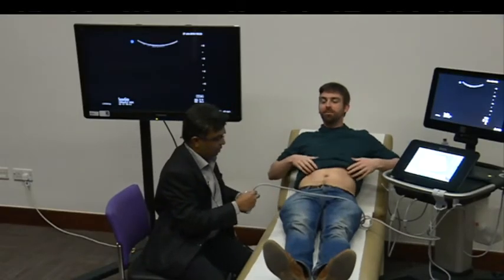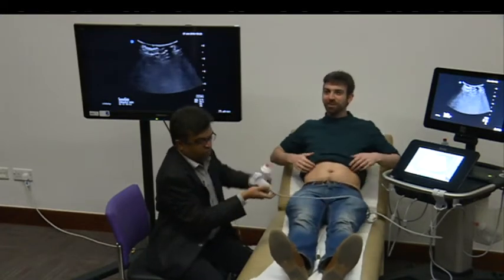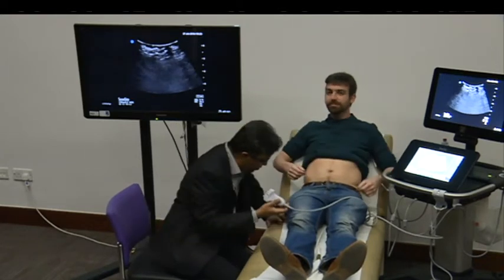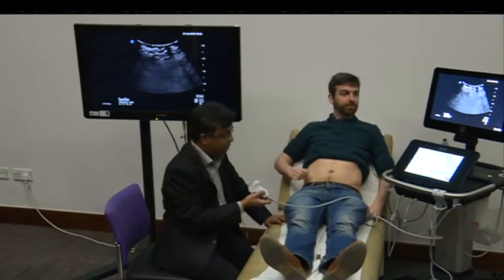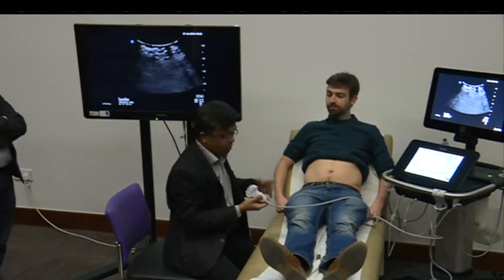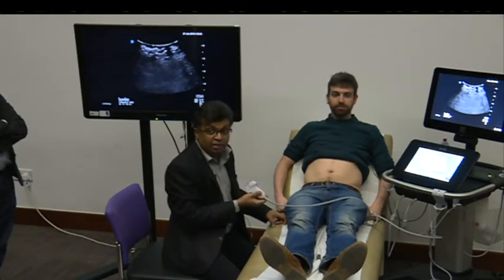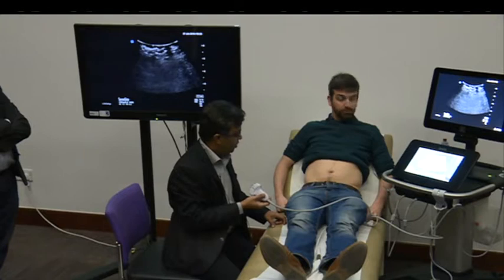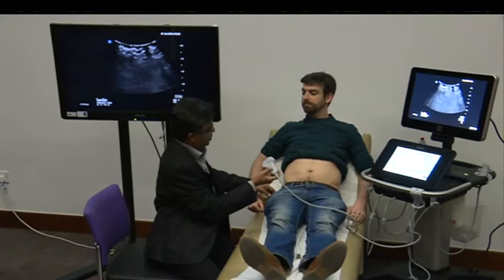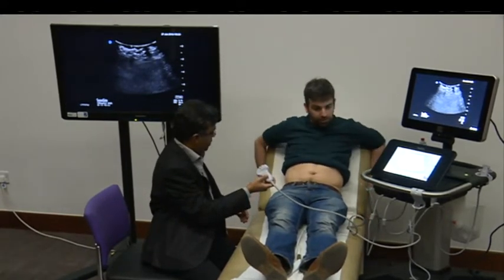I haven't had any breakfast - deliberately. I do this for all my pre-op patients mostly, because it gives you the reassurance of whether the stomach is full or empty, solid or liquid - what are we going to deal with - so we can apply a little bit of common sense in our rapid sequence induction. Supine - you need to go supine.